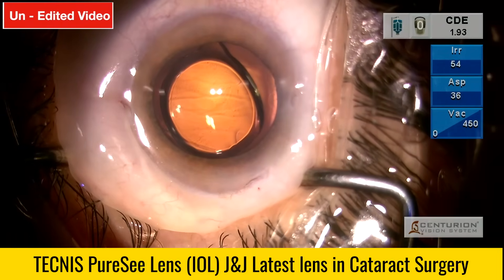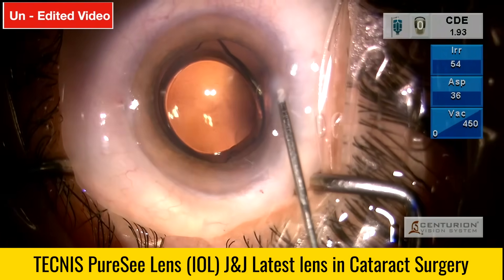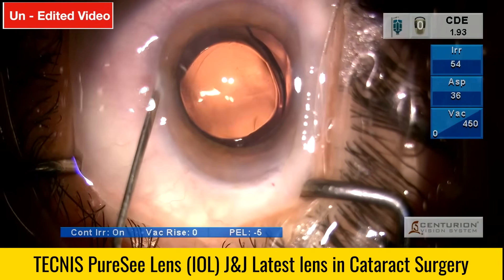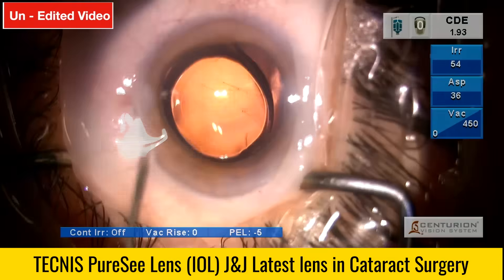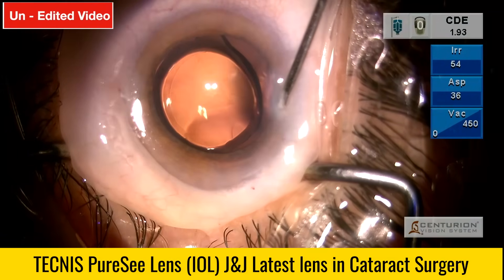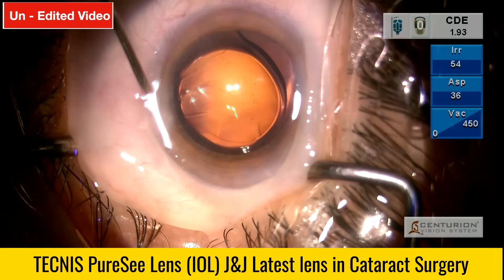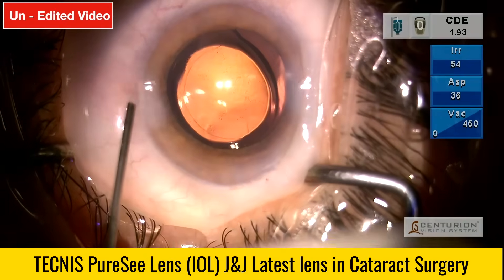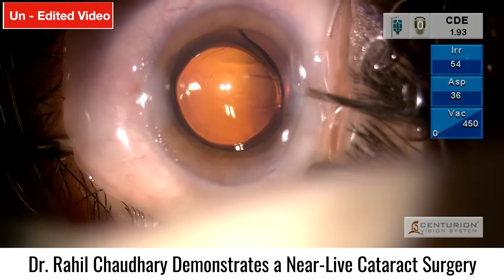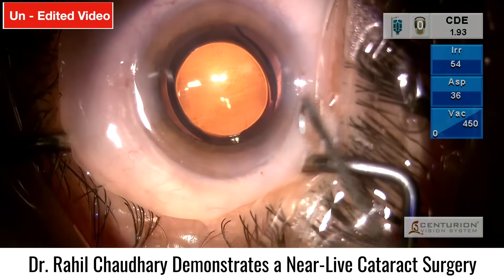The surgery is almost complete now. Just hydrating the wounds and making sure the lens is nice and centered in the bag. The lens appears slightly decentered, so going back in to center it properly.